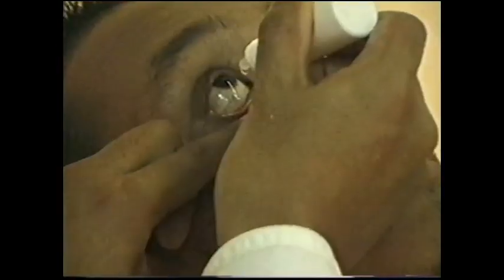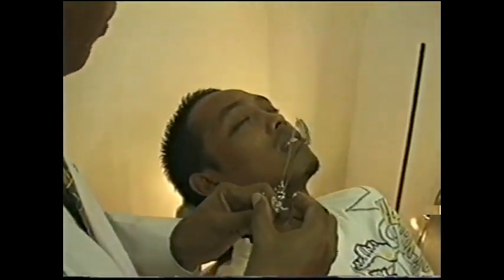Firstly, apply your topical anesthetic. Look up. Ask your patient to close his eyes gently, without squeezing, to allow proper absorption of the topical anesthetic. Give it a few seconds to about two minutes for the anesthetic to take effect. This will ensure that the procedure is done without any unnecessary pain and discomfort on the patient. Then you may proceed with Schiotz tonometry.